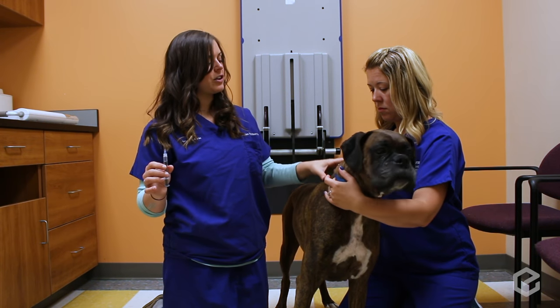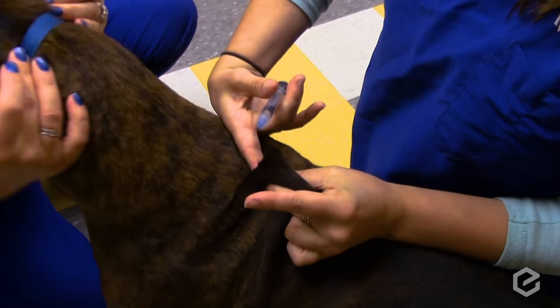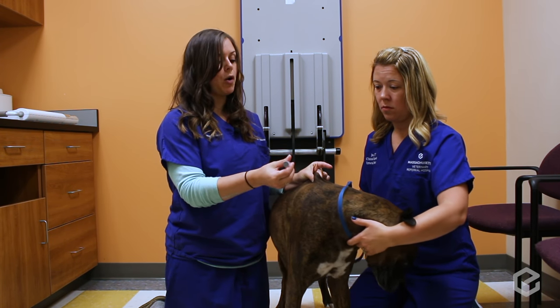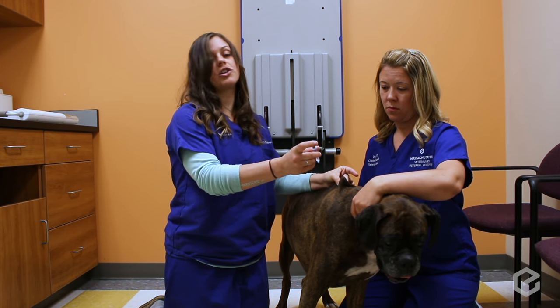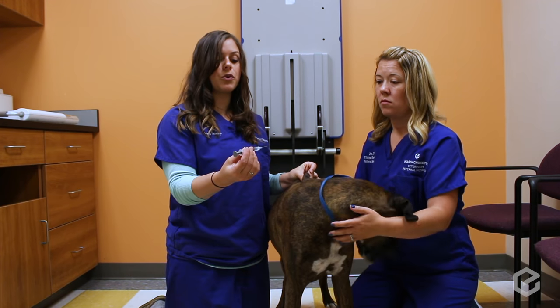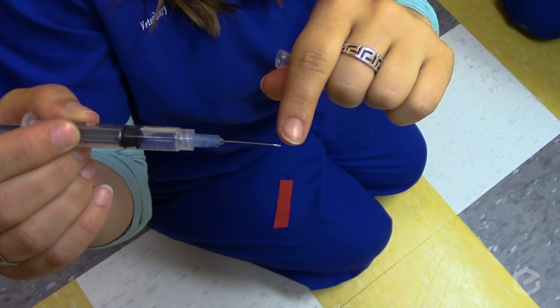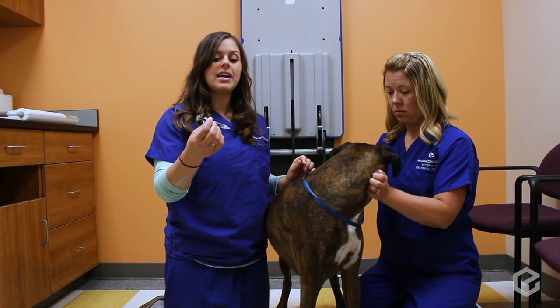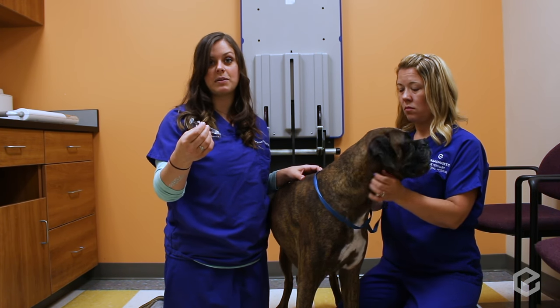Again, middle finger and thumb, pull up, and use your pointer finger to find that pocket, making sure the needle is pointing away from you. Keep your finger off the plunger when you go to poke so that you don't inadvertently squirt all of the medication onto your pet's fur. Also, make sure you keep the bevel up on your needle — you'll see a little hole on top where it tapers to a point. That's the way the needle should go in, with that hole pointing up, not down, because the fluid will flow in much easier and it will poke into the skin much easier.